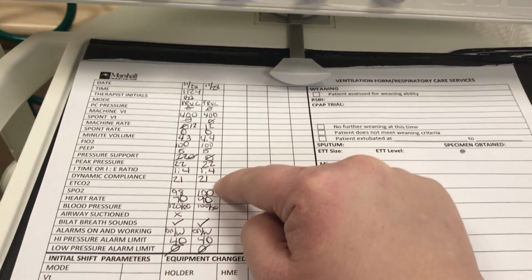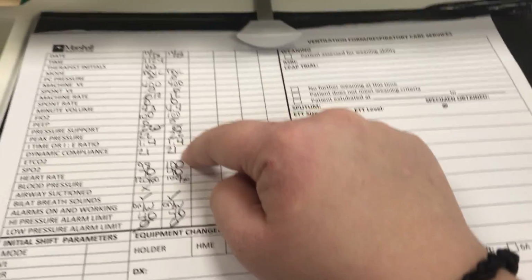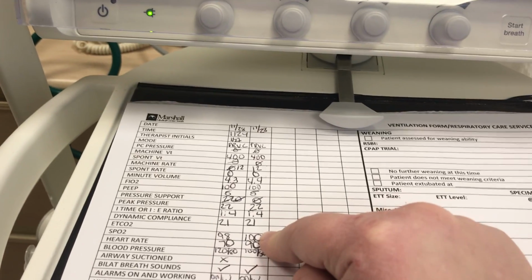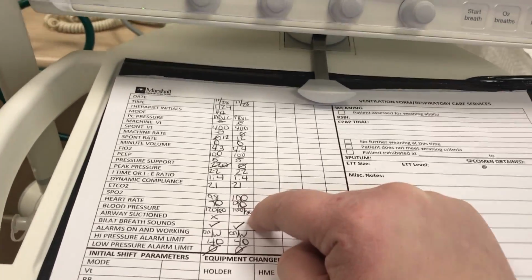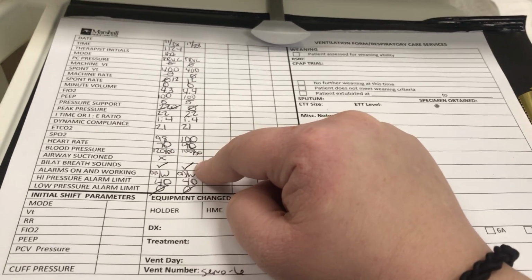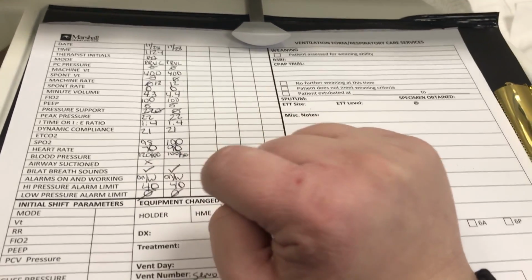Then I'd look at my ETCO2 machine behind there and get that number and write it down. My SpO2, heart rate and blood pressure I'd get from the monitor in the room. If I suction the airway, I can either X or check mark it. I've checked for bilateral breath sounds and they have them, so I'm going to check mark it.